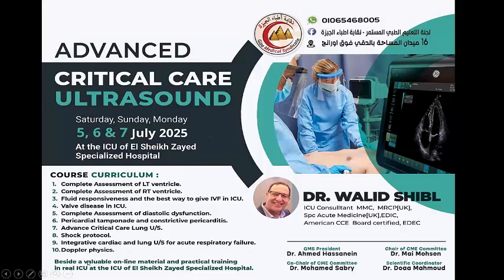And the very important lectures you will receive, the Doppler physics, because Doppler is the cornerstone of advanced critical care ultrasound. You will get a very valuable lecture on Doppler ultrasound in a very simple way to know how to apply Doppler for your patient.